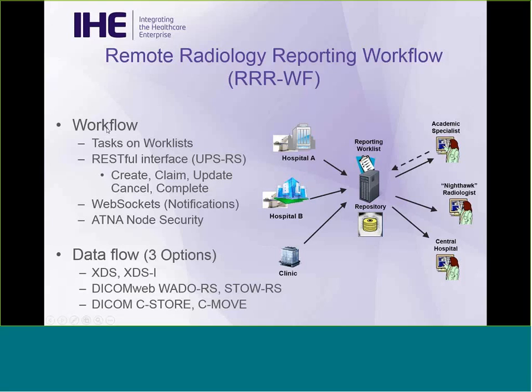Now on top of that, you've got your work lists. And so the idea is you need to be able to put tasks on these work lists. And part of the DICOMweb package includes what we call UPS-RS. So this is the Unified Procedure Step in the RESTful Service version. So again, this is more aligned with FHIR. It allows you to create a work item, claim it, update the contents, cancel it, complete it using RESTful web calls. The structure parallels the earlier simple UPS, which uses the normal DICOM protocols.